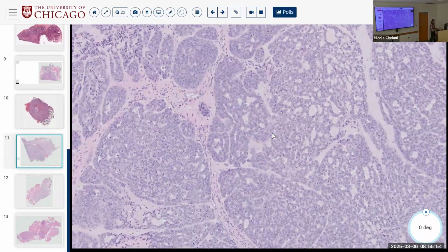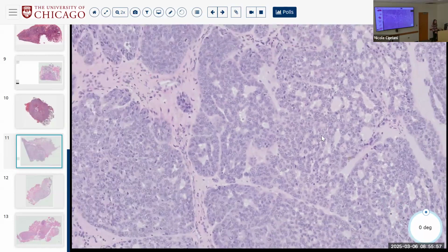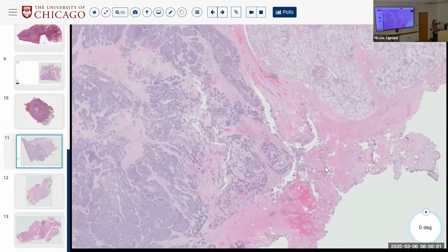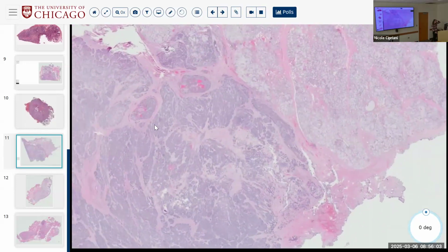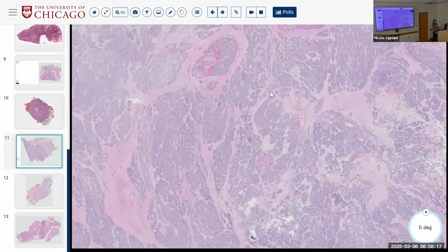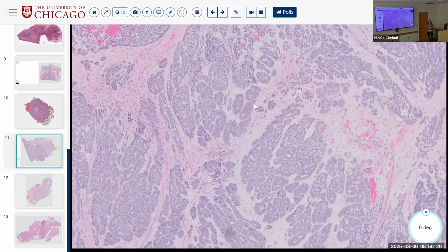Okay, so this in fact is a really good example of polymorphous adenocarcinoma with PNI, with that characteristic whirling or targetoid pattern. On low power, it's very cloud-like, very pale, kind of pale purplish to pale pinkish, rather than that really dark basaloid look of adenoid cystic. So I like to use the high and the low power all together.